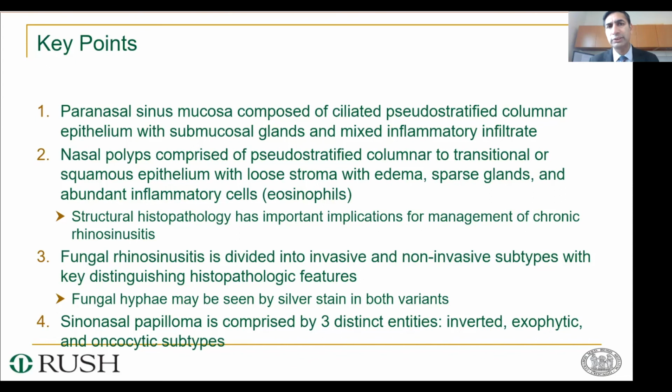When you look at CRS with nasal polyps, you can still have the pseudostratified columnar epithelium, but that can revert to more of a transitional or a squamous epithelium.